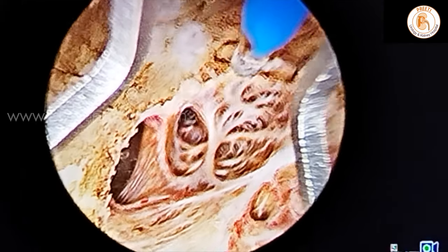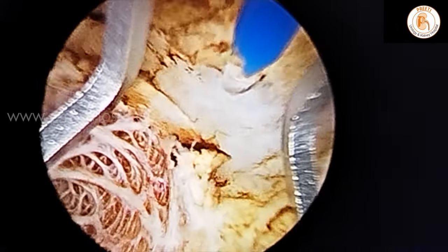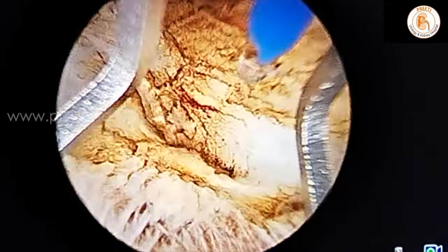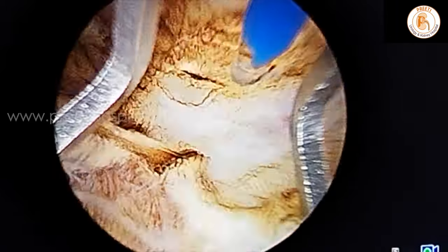Whenever there is a capsular perforation like this — a big perforation — you should be careful. In Indian patients the ureter may be close due to inflammation. If it goes deep, you have to change the plane. It can be easily changed, but that is possible only when you keep the laser fiber at the right position.